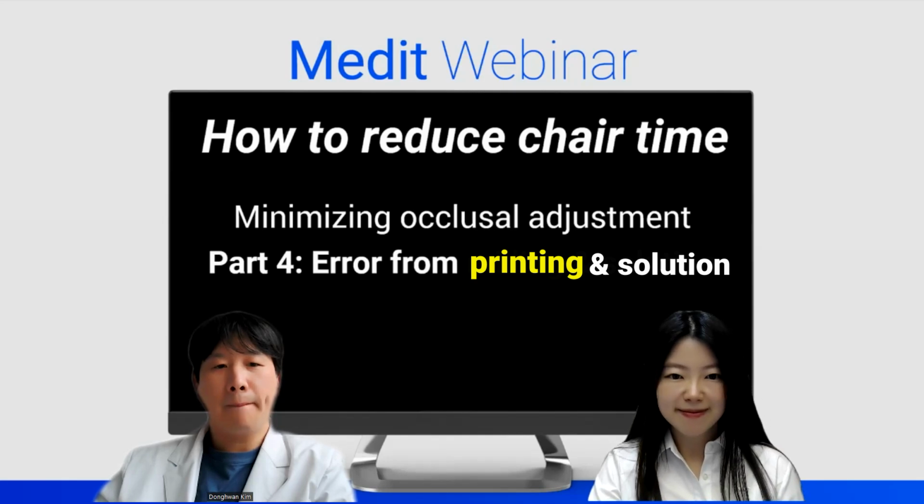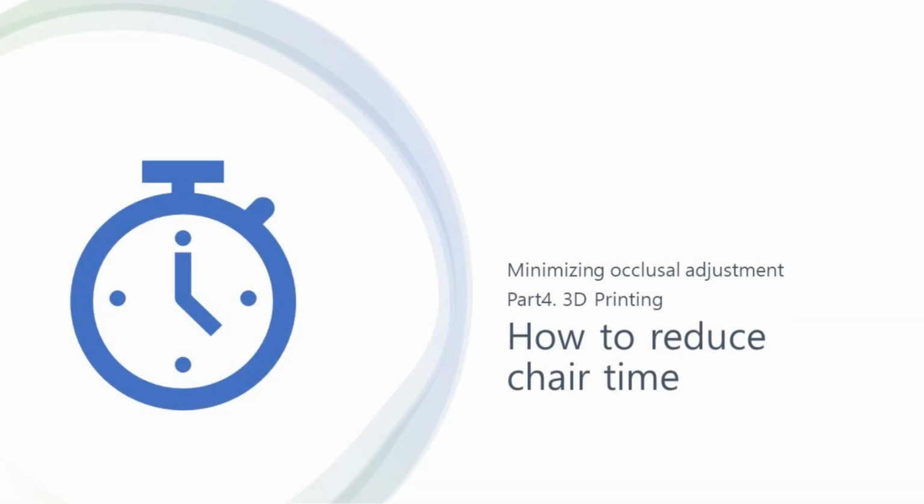Okay. Welcome everyone, and thank you for joining us in the fourth lecture of our Reducing Chair Time for Dental Crowns series. Today, we will focus on identifying and resolving challenges associated with 3D printing in dental crown production, aiming to significantly reduce treatment time.